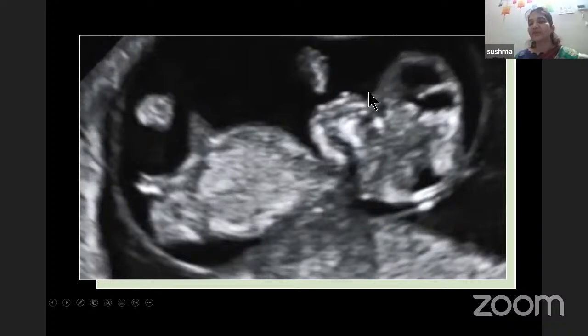So initially, when the bony structure is absent, the bulk of the fetal brain is seen protruding out into the amniotic fluid. And gradually it starts eroding, and finally all the brain gets eroded, and only the brain stem is present, and then we can call it anencephaly. Yes, anencephaly is the right diagnosis.